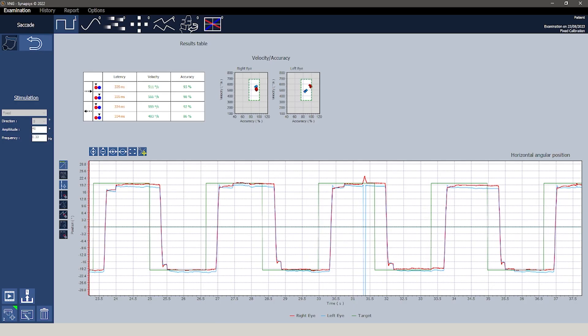The upper section displays an accurate results table which presents data according to direction and gaze analyzed. Parameters such as latency, speed and accuracy are examined in depth.